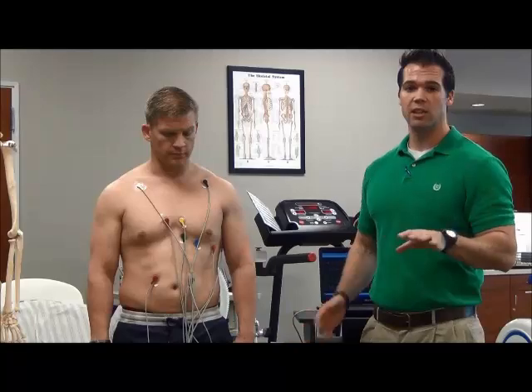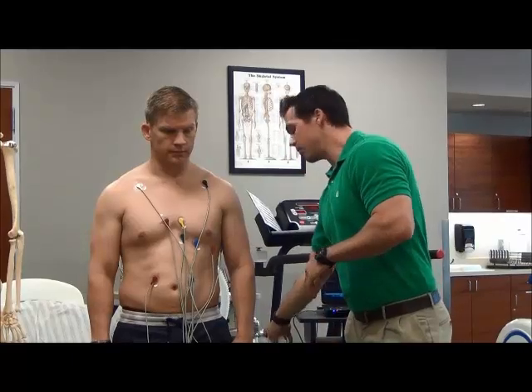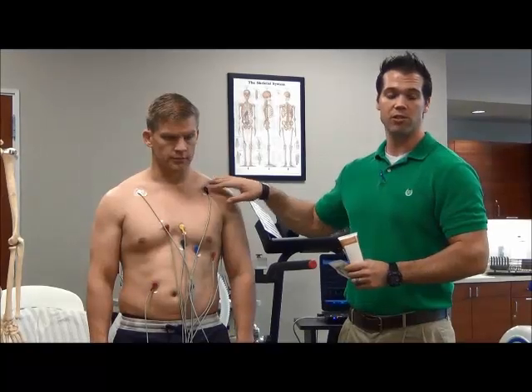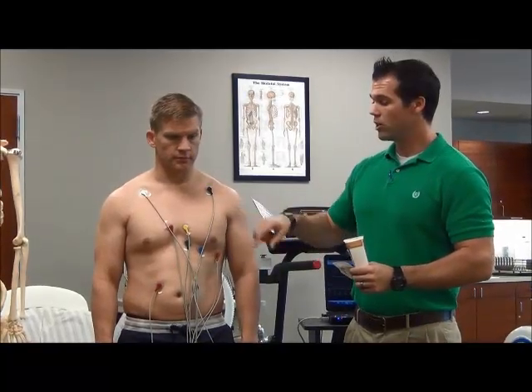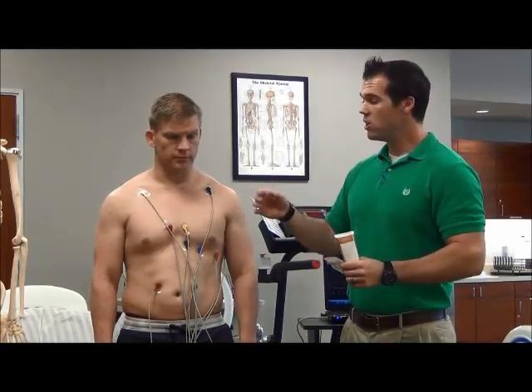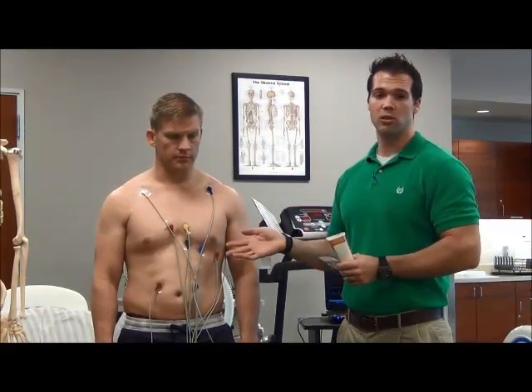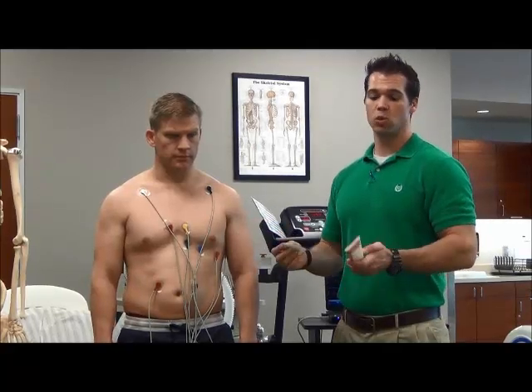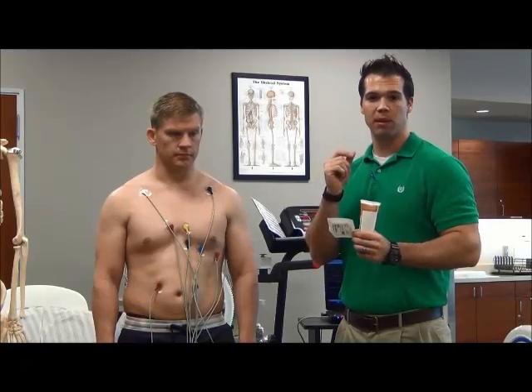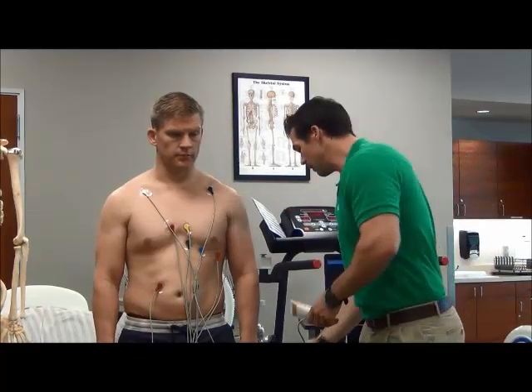One of the most important things to get a good reading on the ECG is client prep. If a client of yours came in, or a patient, and he had a really hairy chest, it would require you to shave the spots that you're placing the electrodes, or you wouldn't get a good image. So first thing, luckily Curtis is shaved, but you would shave the spots where you're going to place the electrodes, and then you'd want to rough the skin up a little bit. Most companies that sell any sort of ECG machine will sell some sort of lubricant that has almost like fine sandpaper that you would put on some gauze, and you would rough the skin up a little bit, and then you could place the electrode on there.